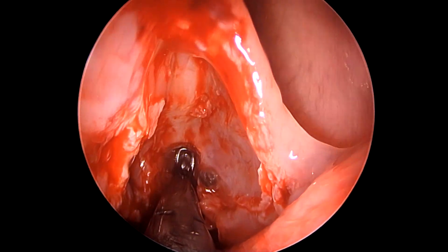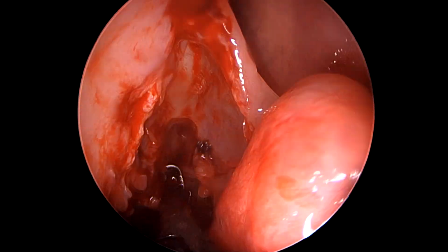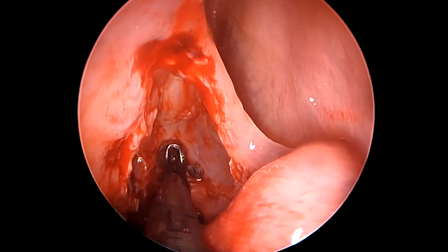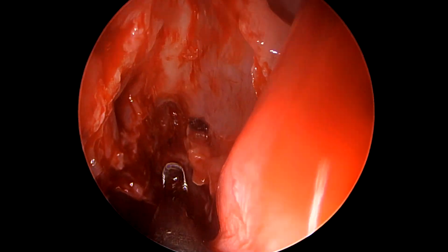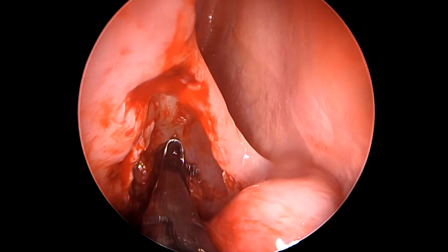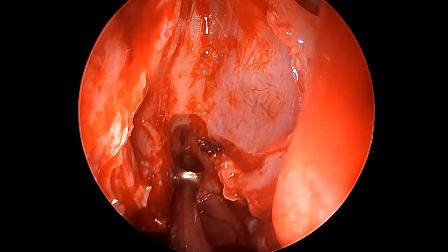As you can see, the moment we articulate with this extremely curved punch, it creates a conflict with the endoscope, and the vision temporarily goes. So it's very important to articulate firmly and clearly, and if in doubt, one has to be very, very sure before we do so that we do not injure any other structure here, most likely the orbit. Since we are articulating anteriorly and not posteriorly, it is very hard to injure the skull base proper unless somehow the instruments get jammed inside, or we try to forcibly remove it.